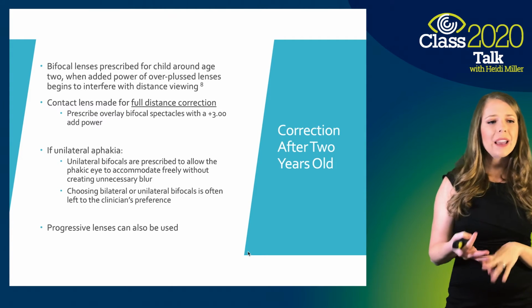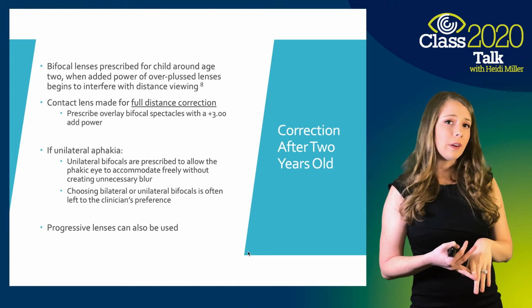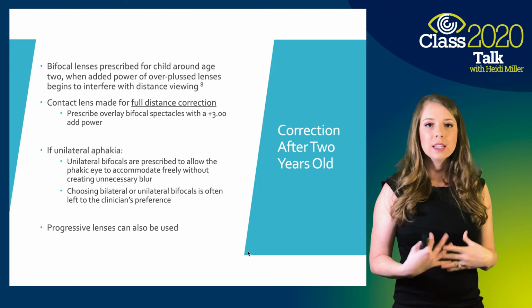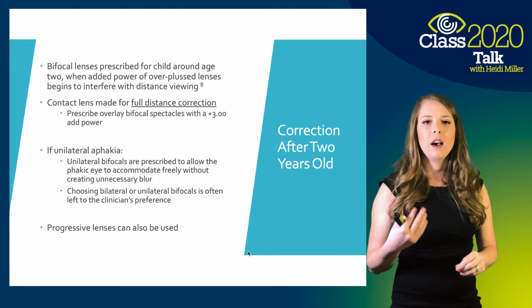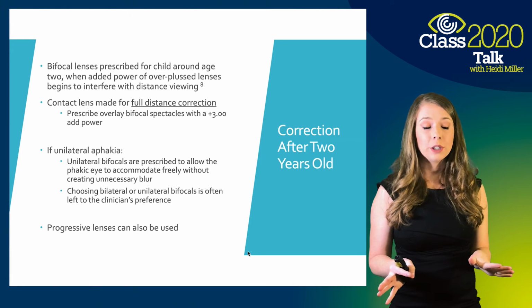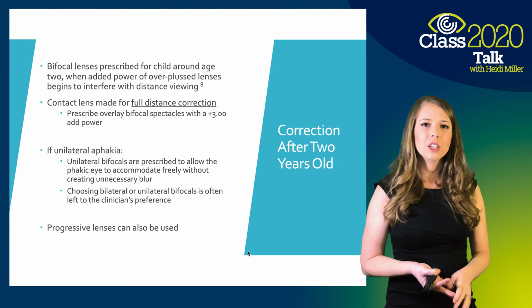And bifocals can be bilateral or unilateral. I think it really depends on the clinician. In my practice, I do unilateral bifocals just because I want to let the phakic eye accommodate freely without any unnecessary blur. I've seen other offices where they do both and the patients do fine as well. So it's really clinician preference.